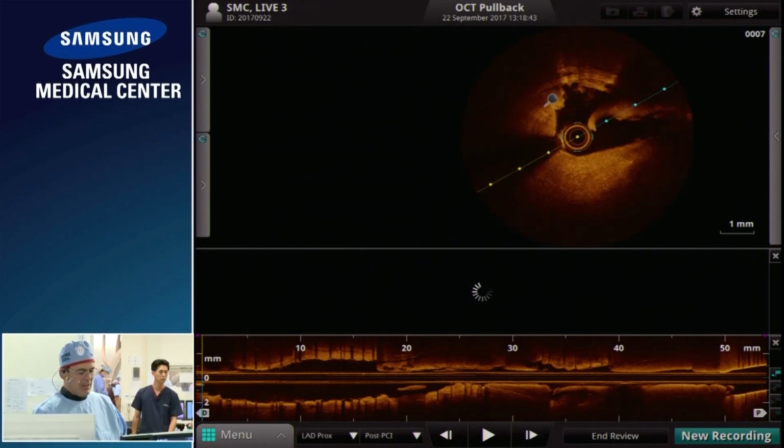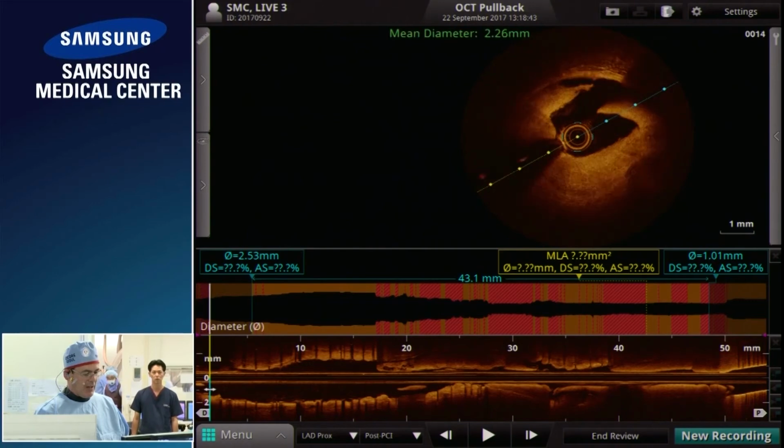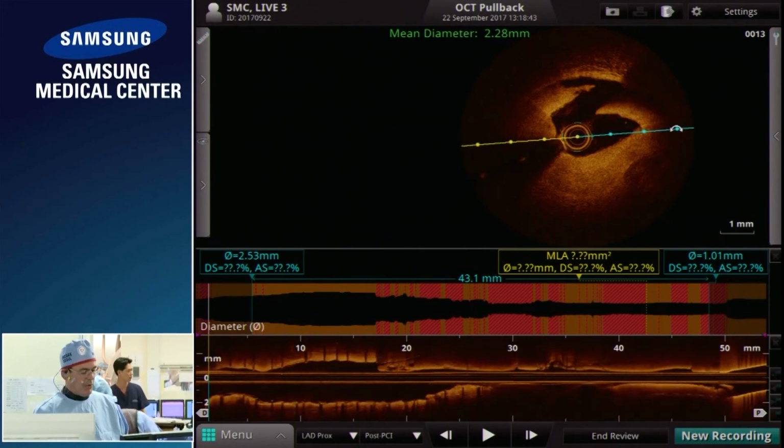So this is soft plaque at the end of the stent, and this is an almost occlusive dissection. Angiographically, you can see this segment. Certainly, if you're using the OCT criteria from the Illumien trials, this is something you would treat. And that's in fact what we did. I should have used a 3.0 stent instead of a 3.5 with the low pressure. I tried, but I couldn't avoid the dissection at the distal stent edge. So I'm sorry for that.